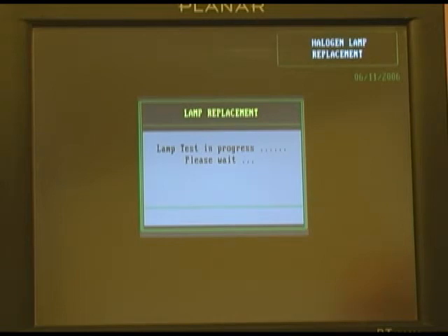The system will now take the new lamp, turn it on, allow it to come up to temperature, and then once again compare the optical density between the two filters. And if the new lamp passes, you'll see this procedure was successful. If so, hit F10 or spacebar to proceed.